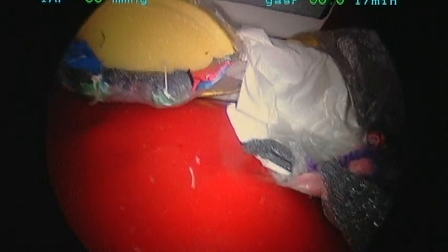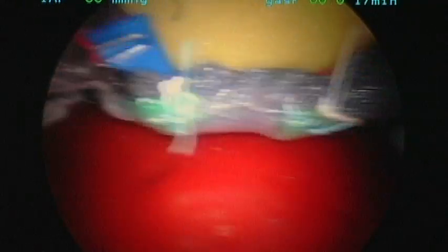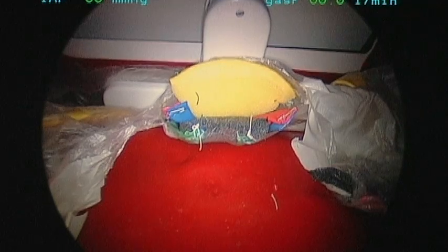Excellent. We've removed our needle, we have complete closure of the cuff, and we're done.